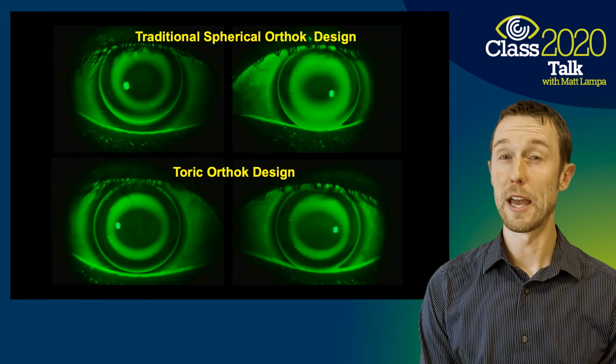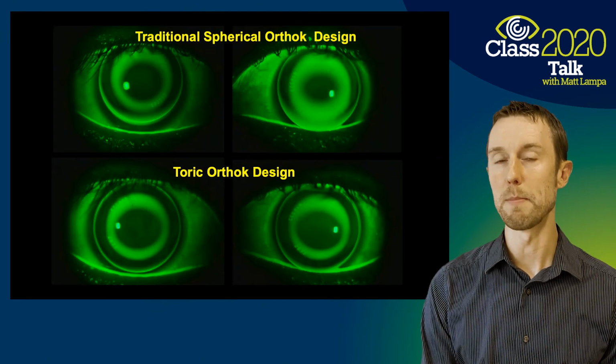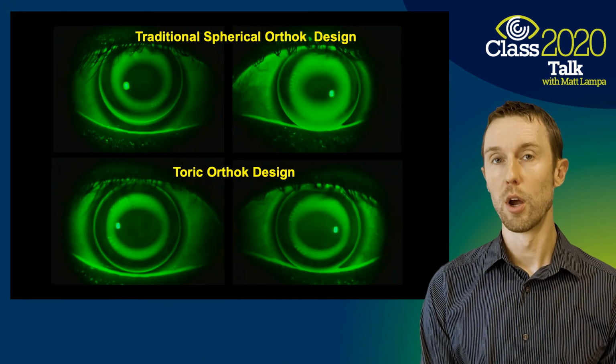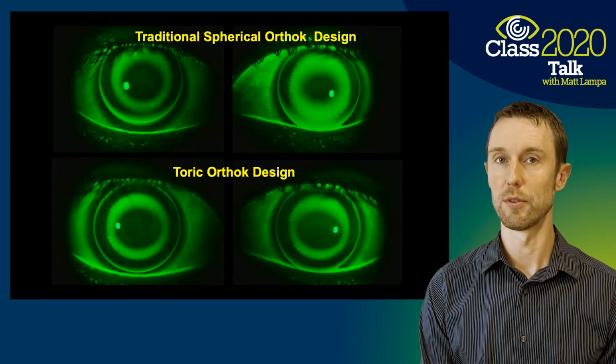But I think where we get the most clue is in terms of that corneal sagittal height differential taken at that 8mm chord, and then passing that value on to our orthokeratology lab partners, and then better designing lenses to align our patient's cornea for a more successful orthokeratology outcome.